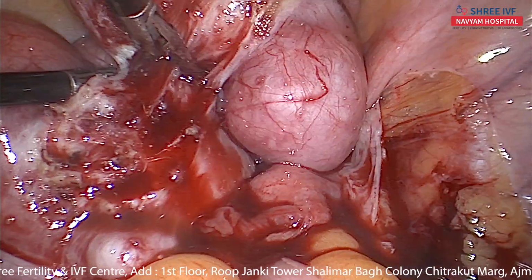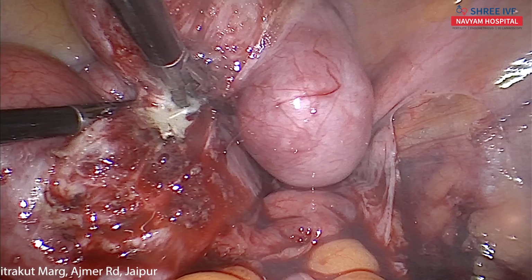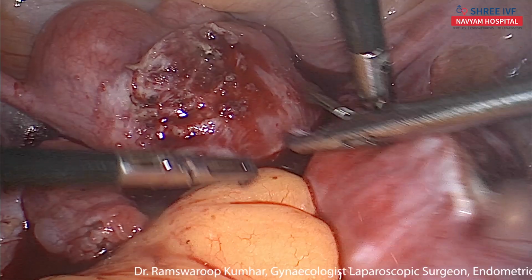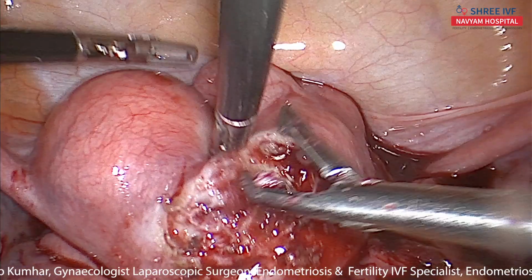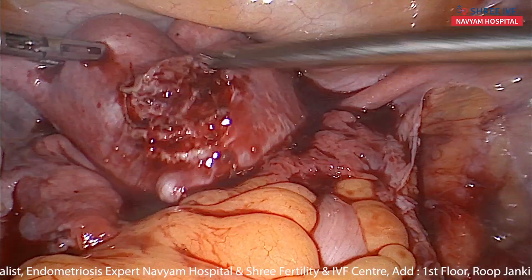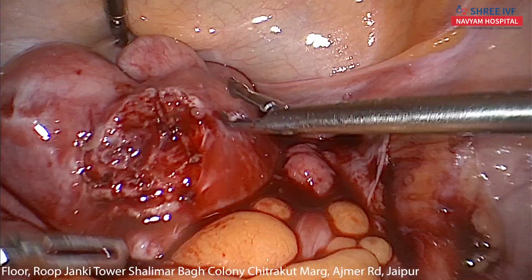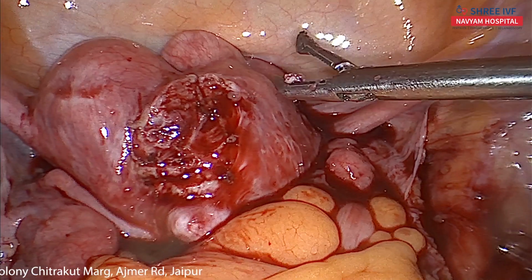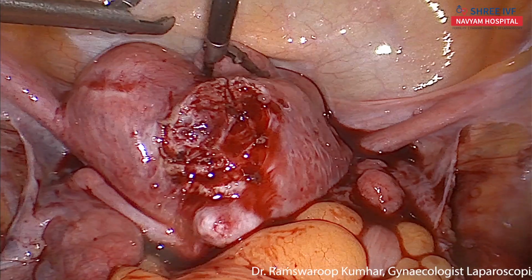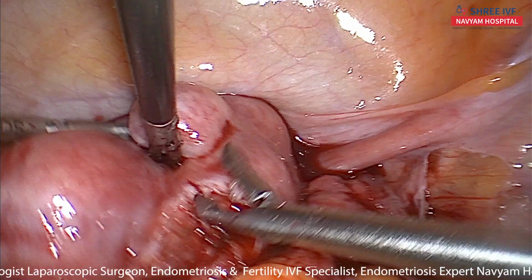And catheter, do it. I am using the shears with both coagulation and cutting at the same time. First myoma is out. Now we will give an incision so that every myoma can come out from the same incision. So we will give it anteriorly first. And the bladder is filled.